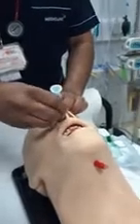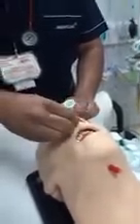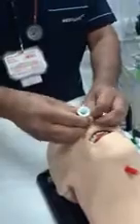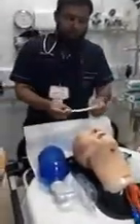It will go beyond and it will go inside. So this is the nasopharyngeal airway. We have to pass it in a rotating fashion.